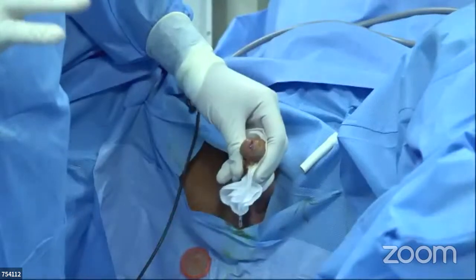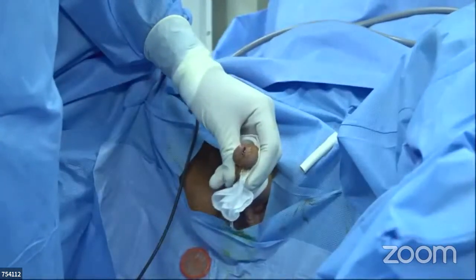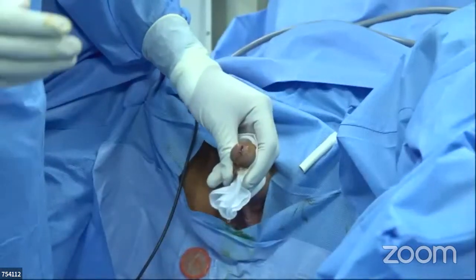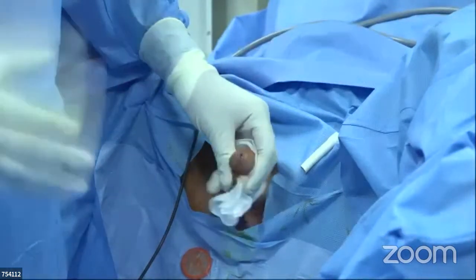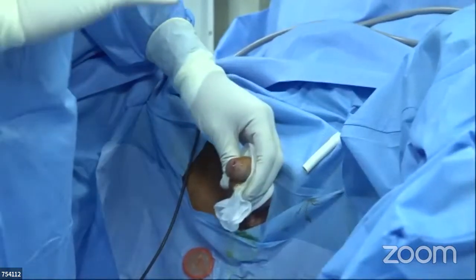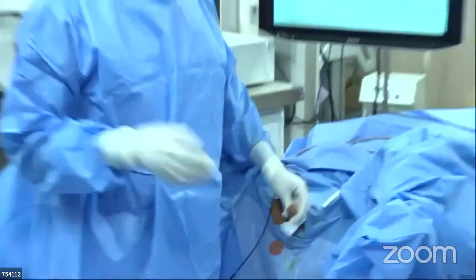At one point of time, you still remember, we were using 26-sized catheters after a TURP 35 years ago. Then we came to 24. Then we came to 22. Now we are using only 20 French three-way catheters after TURP. So we all started believing the instrumentation size or catheter size does have a role, not only the size and the nature of the urethra, in postoperative stricture formation. I need your comments on that.